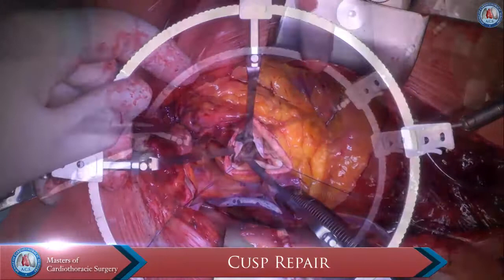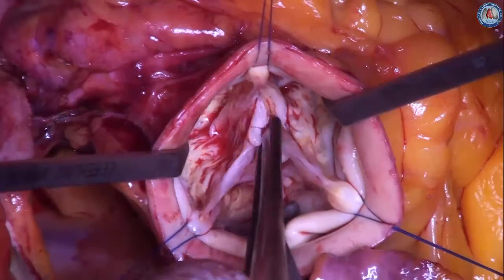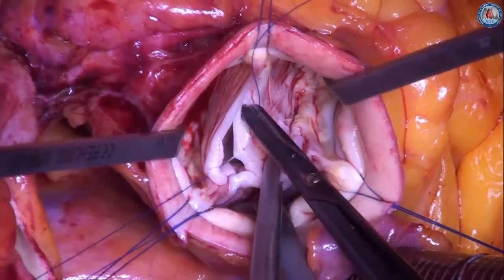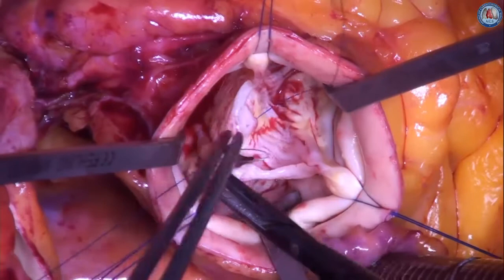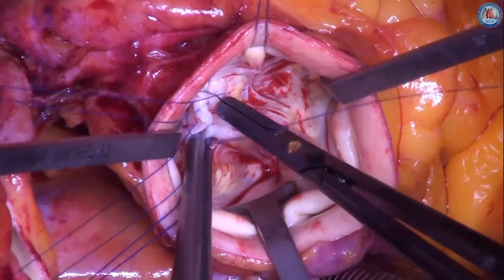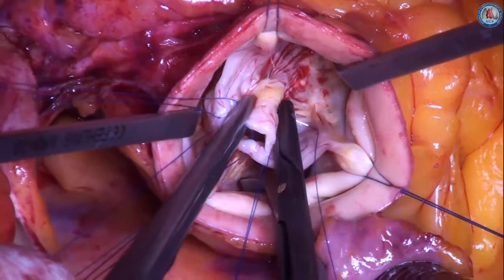Once the annuloplasty is completed, correction of cusp prolapse is performed. Stay sutures are placed through the free margins of the cusps. Prolapse correction can mostly be done by plication of the central part of the cusp, carrying the lowest diastolic stress. To prevent later billowing of the cusp, plication stitches in the belly of the cusp can be added.